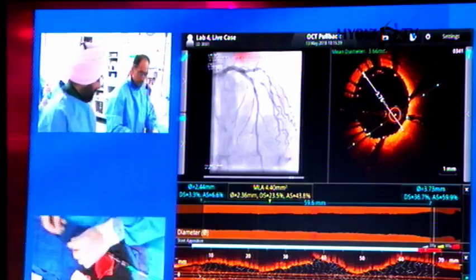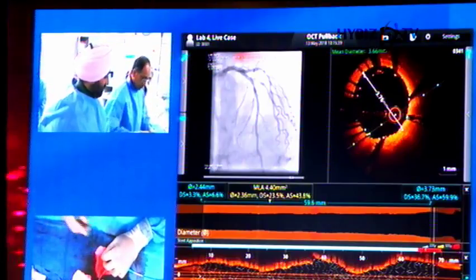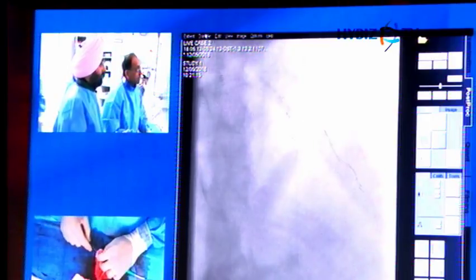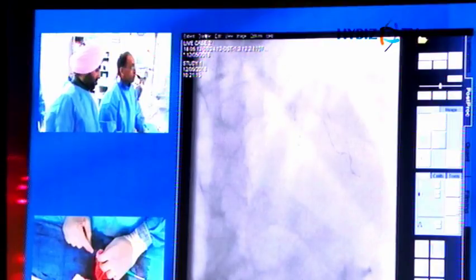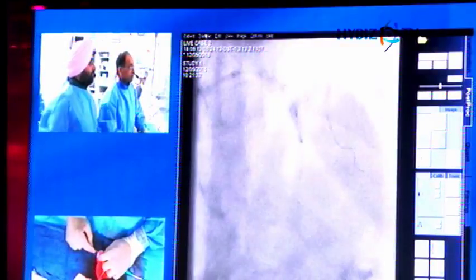Okay, so this is a new 3 balloon. Hopefully she'll go through. The first balloon was getting stuck in the proximal struts, and that's smoothly through. Can you go up to the midsection, please? Thank you. Go up there. 6, 8, 12, 14. 14 atmospheres. 14. And down, and then we'll do the next section there.